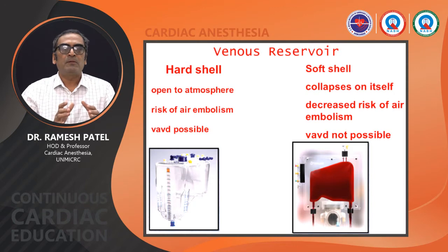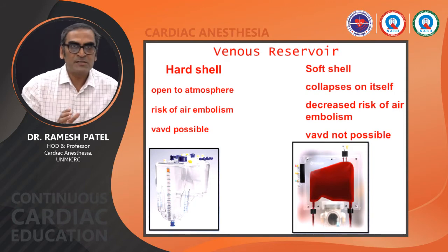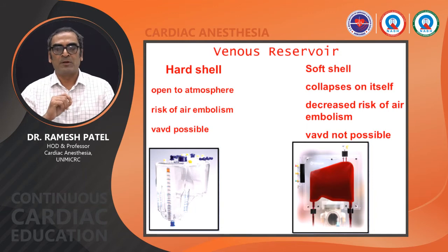The hard shell reservoir is open to the atmosphere, so there is a risk of air embolism. Vacuum assisted venous drainage is possible in a hard shell reservoir, but not in a soft shell reservoir. Soft shell reservoir is collapsible and decreases the risk of air embolism, but is not used nowadays.